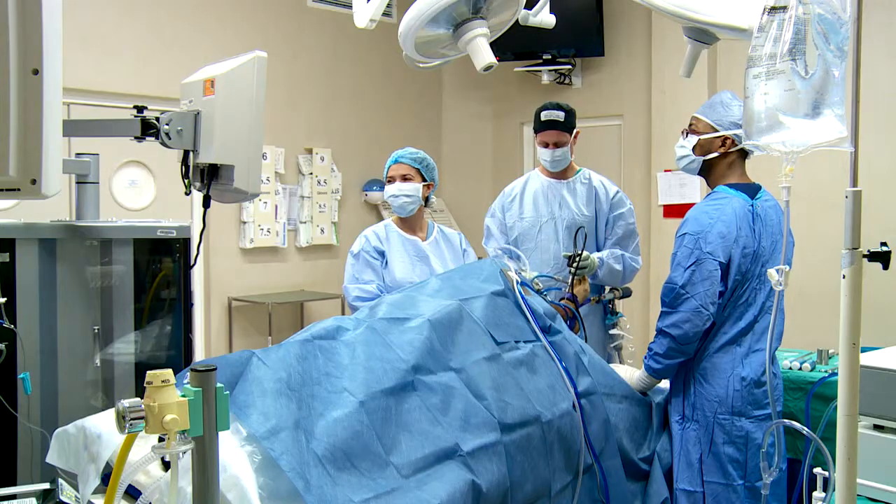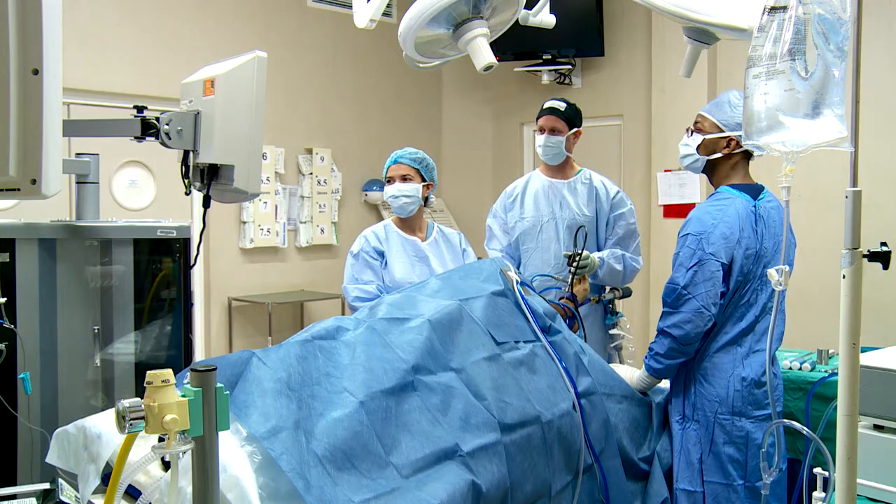You are then able to go home on the same day. At follow-up two weeks after the surgery, you'll be shown pictures and videos of the procedure performed. The wounds will be reviewed and no stitches will need to be removed as all the stitches will dissolve. Full recovery and return to normal sports is expected at three months after surgery.